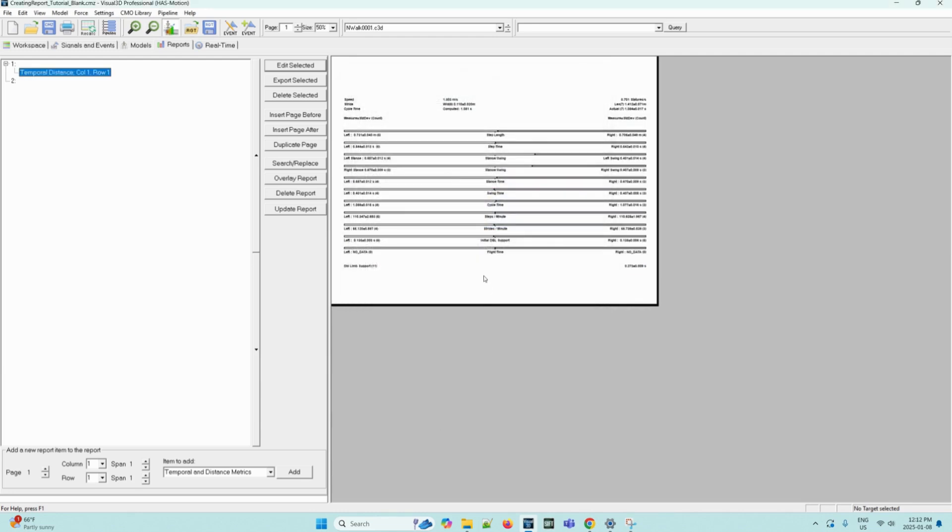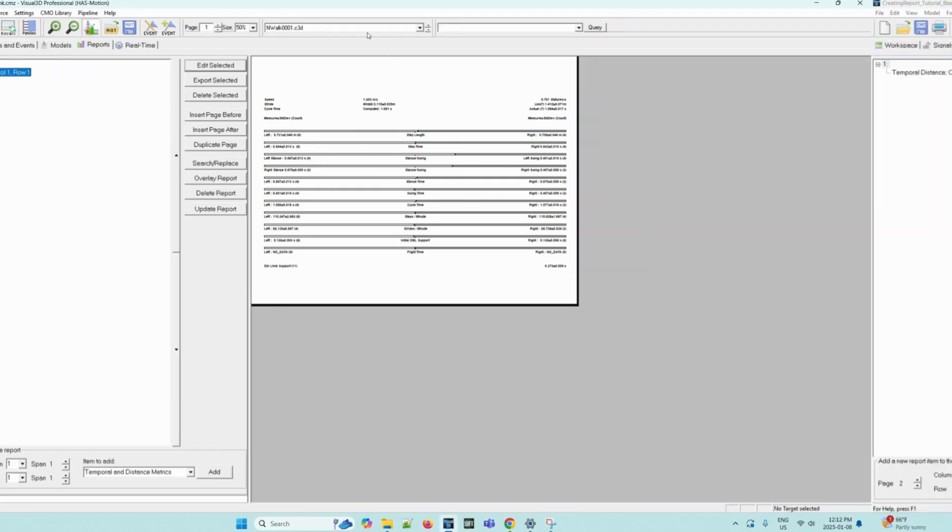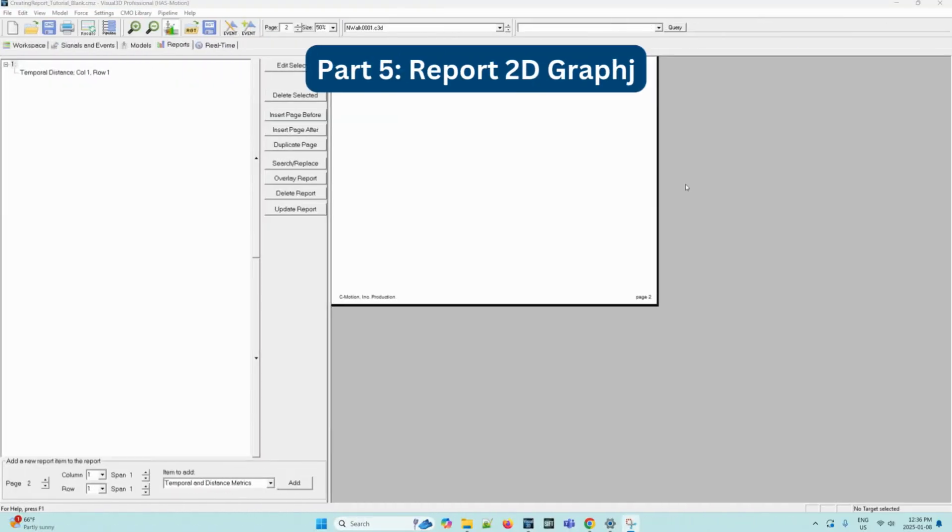As you can see, the updated report has all of the selected metrics and we are able to see them here. Moving on to the next page of our report, we will be displaying a 2D graph.